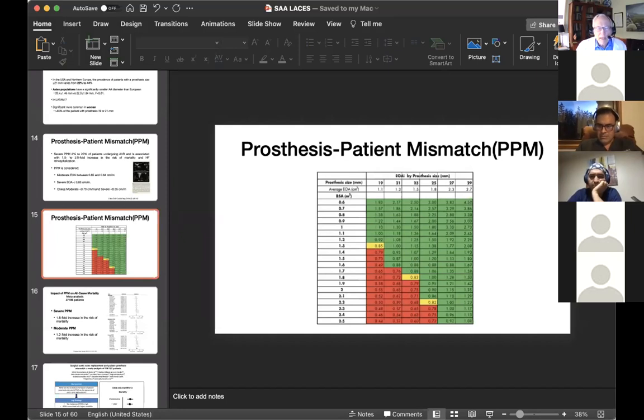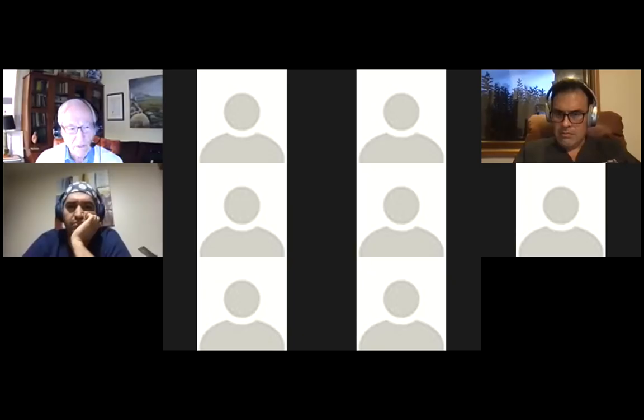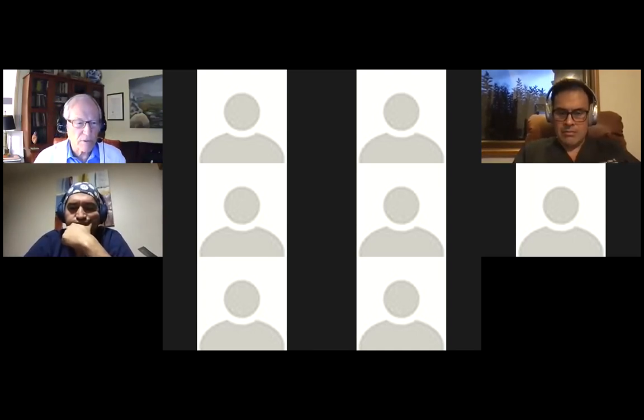So it makes the Magna Ease look a lot better. If you put a Magna Ease 23 against a Hancock 23, the Hancock has a smaller annulus, but they're still listed as 23, and it's very confusing. I think that's why in the smaller valves we like to use the Magna Ease or the Paramount, because of the way the valve's designed. One of our surgeons in Toronto, George Christakis, wrote an article criticizing the industry many years ago, and nothing changed. I think they measure different things and then put these numbers on the valve. It's very confusing.